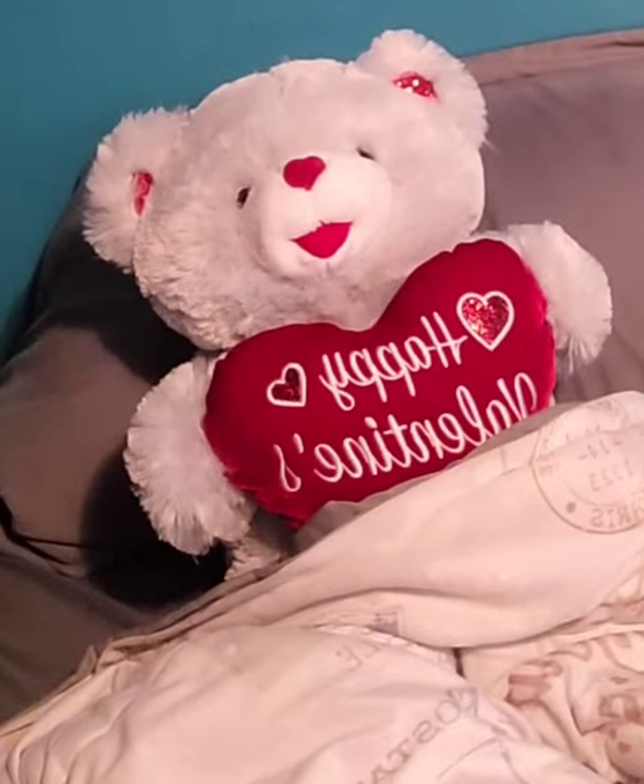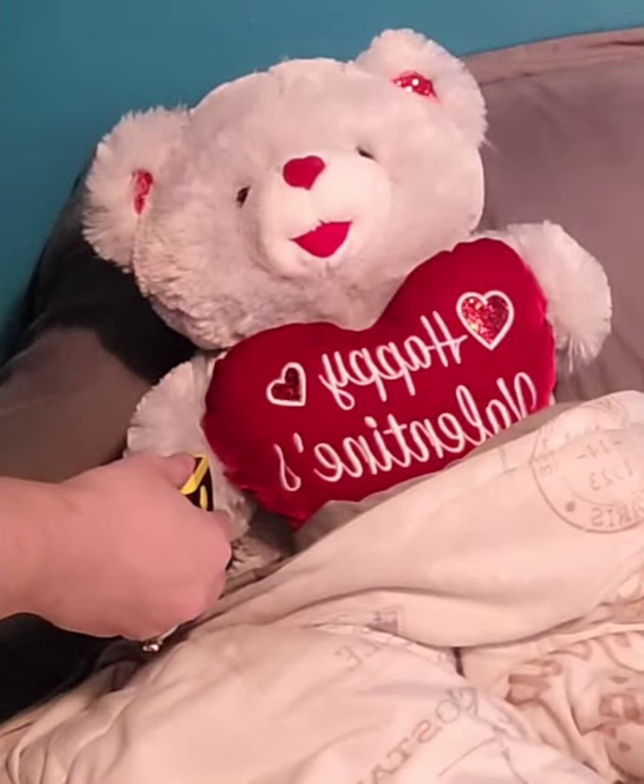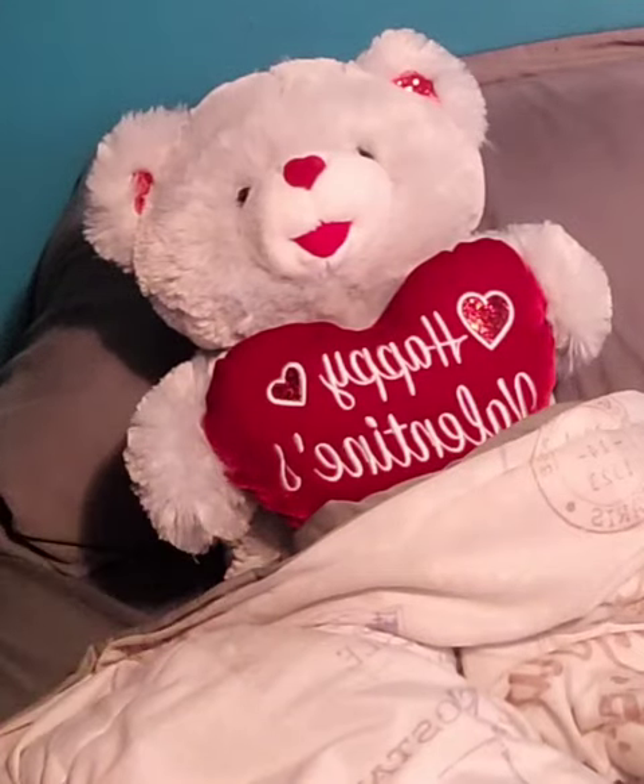Alright, good job. And then I'll just get your heart rate and SpO2 again. Alright, great job.